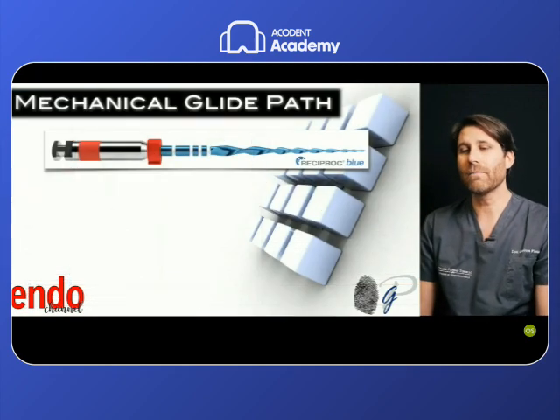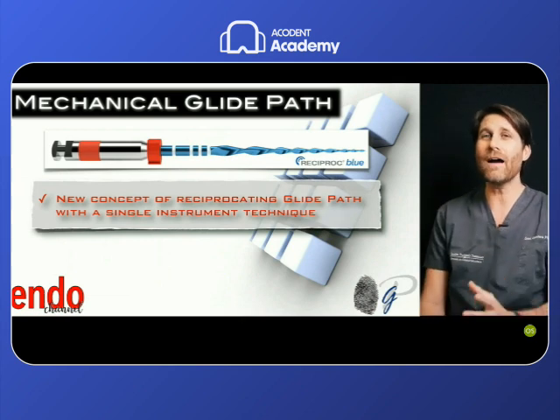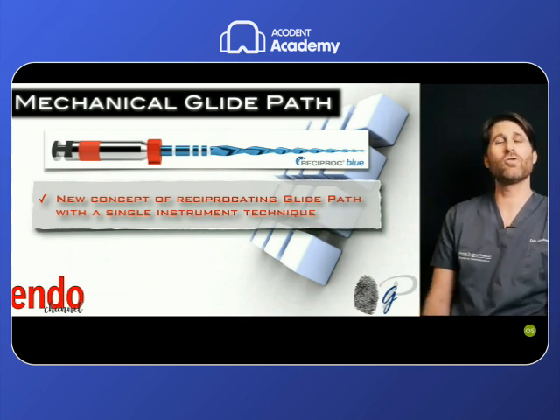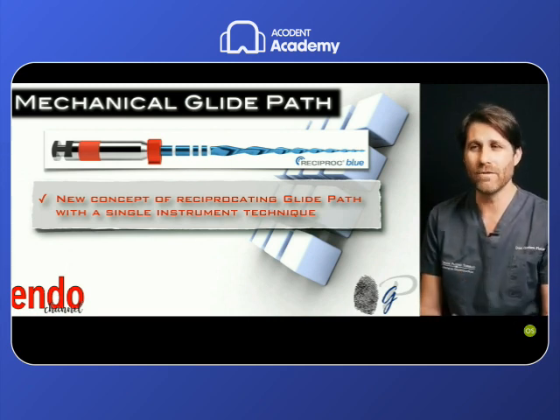But there are some cases in which the 10 stainless steel file cannot reach the working length even after the coronal preflaring of the coronal and middle third.